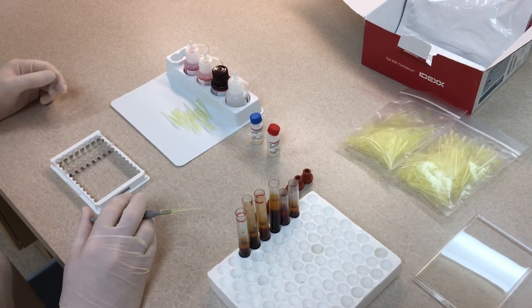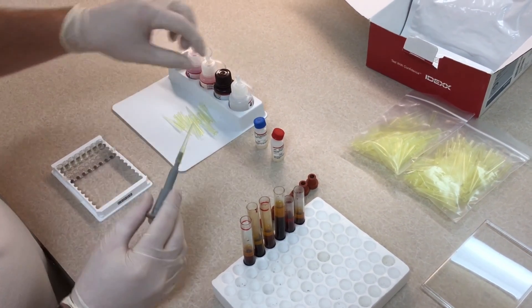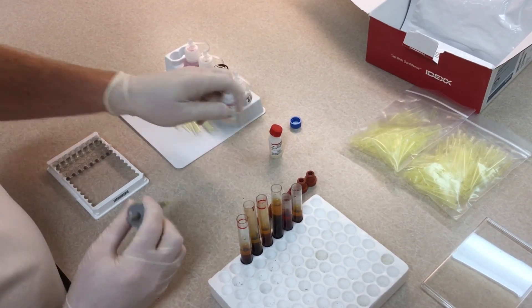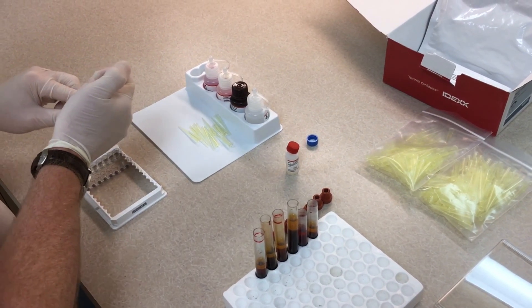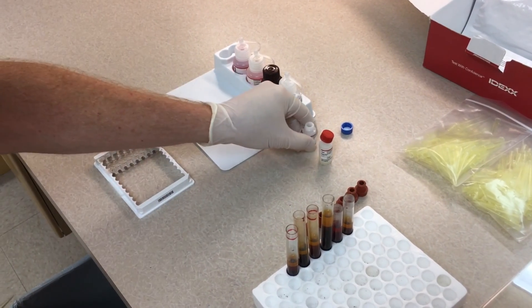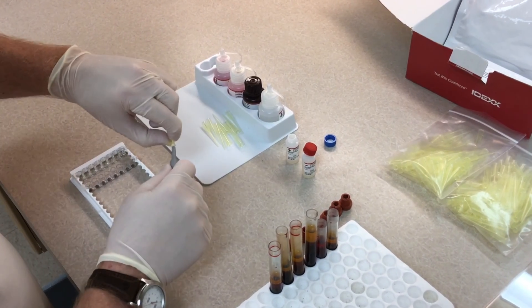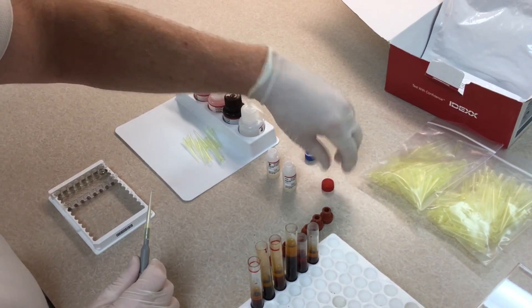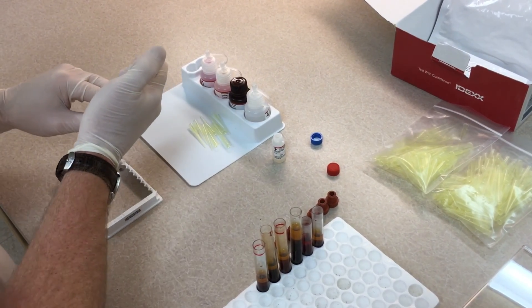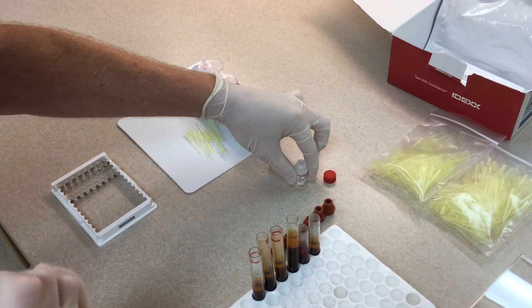To get started, put a new tip on your pipette. We're going to use the positive control — pipette some of it out into the pipetter and then into the very first well at the top of the row. Then take that tip off and put a new tip on. You want to use a fresh tip for every control and sample. Get your negative control and pipette it into the second well, so you have positive and negative control in the first two wells.